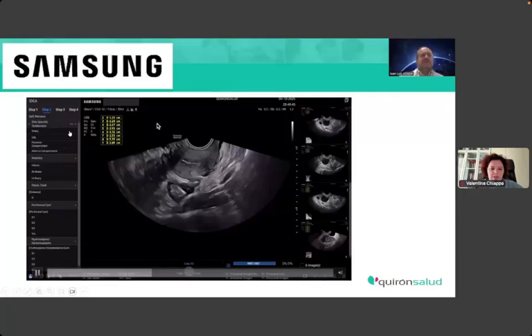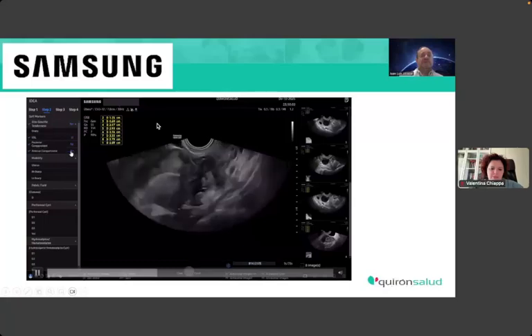This is because we observed pain where the uterosacral ligament, you see, already you see a nodule here. So this is a painful point for the lady. But we don't observe any other site-specific tenderness, painful points.